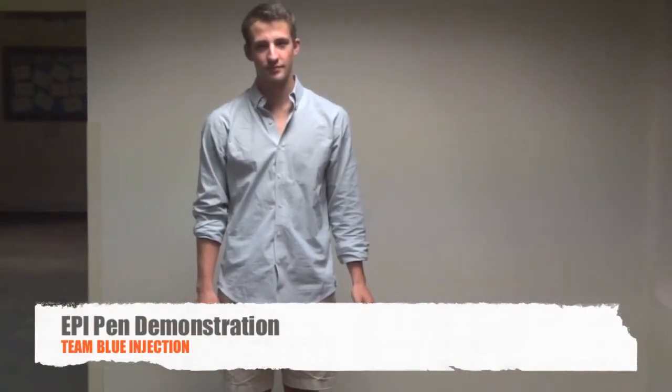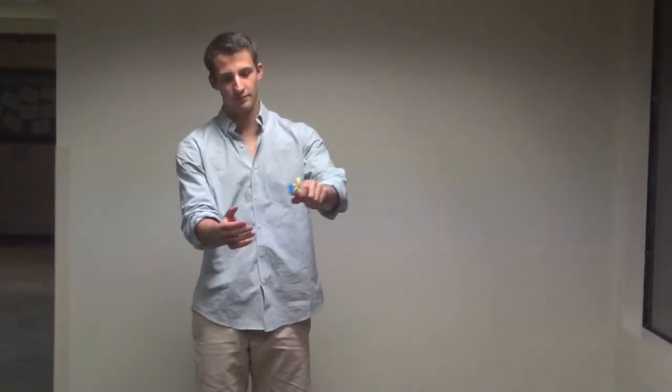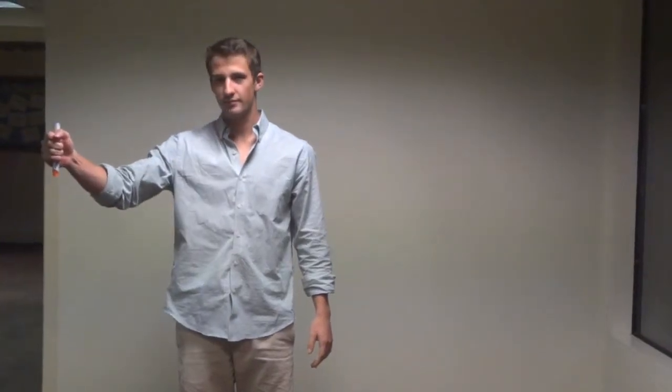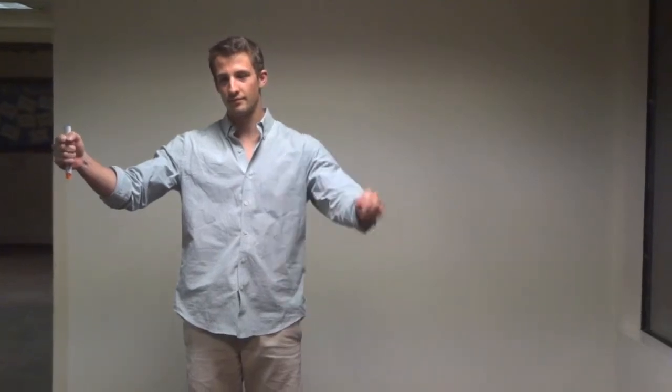Flip open the yellow cap of the EpiPen. Remove the EpiPen by tipping and sliding it out of the carrier tube. Grasp the unit with the orange tip pointing downward and form a fist around the unit. With your other hand, pull off the blue safety release.